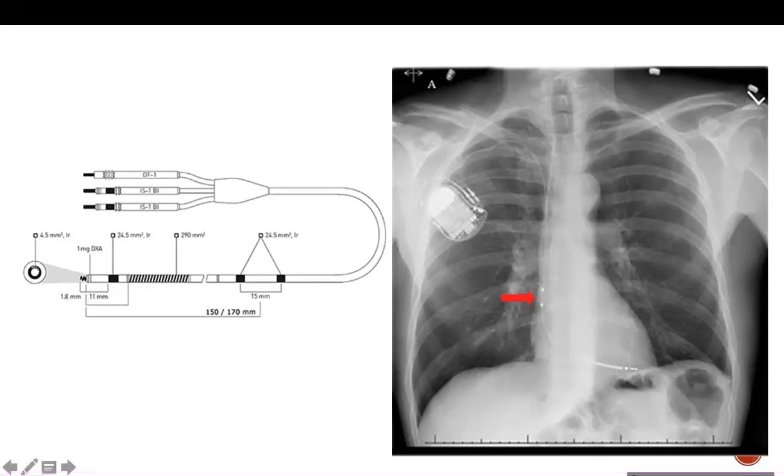The other thing is that some people who have paroxysmal atrial fibrillation used to have an atrial defibrillator. There is a coil attached to the atrial lead, and they would be instructed on how to activate a shock from their device. They would stay at home, take a little bit of benzos just to relax, and deliver a cardioversion shock themselves. But that's not used anymore.